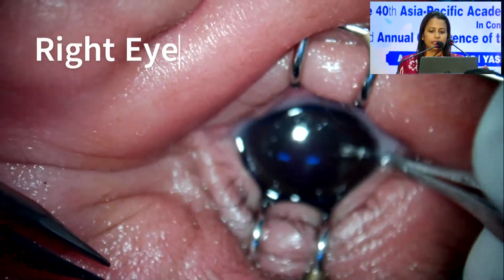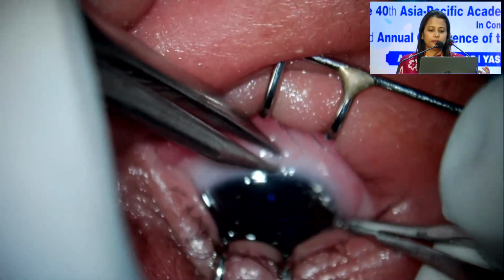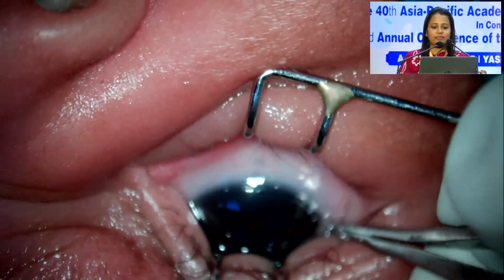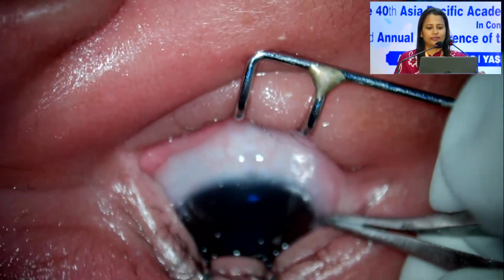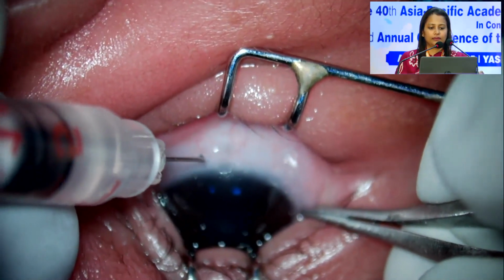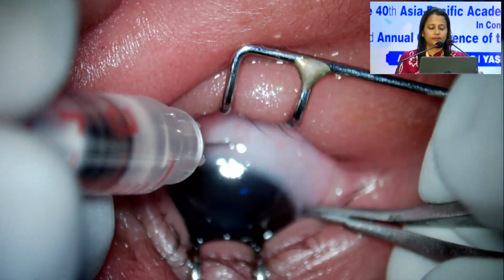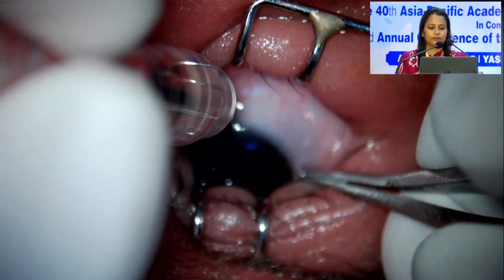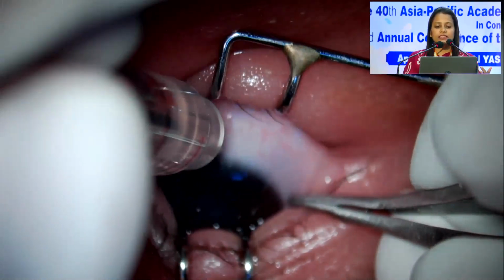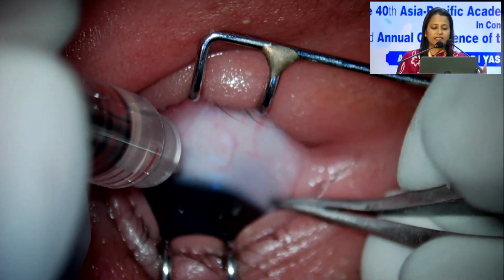This is the other eye. We really tried hard to get a better video. And we don't push the plunger ourselves. It's the assistant who actually pushes the plunger, because both our hands are busy.